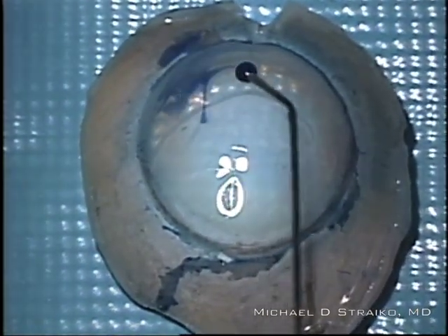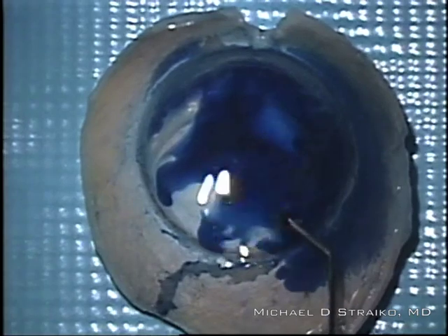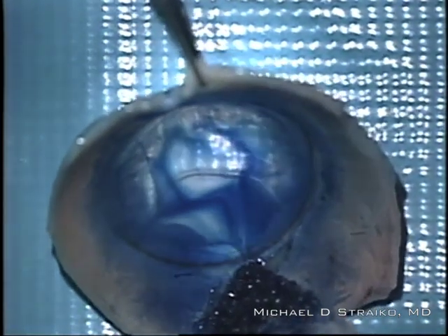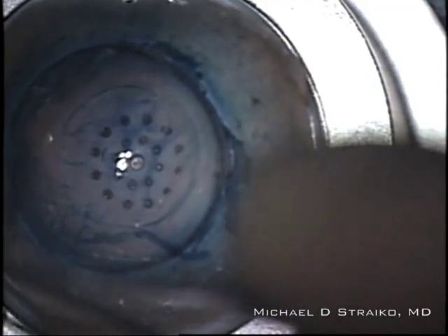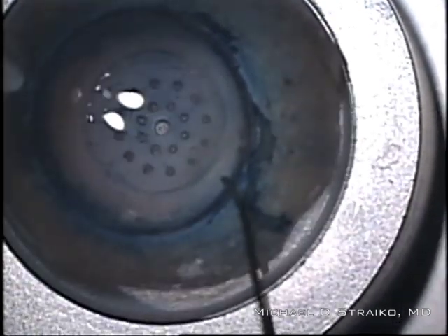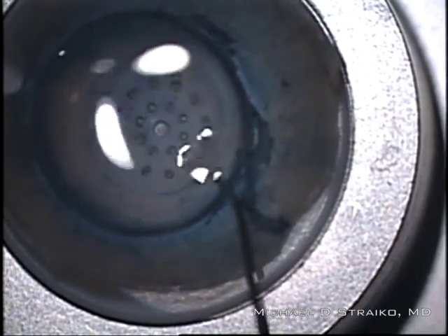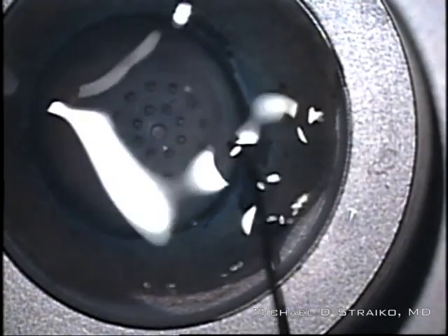I just think it's an interesting exercise to look at how a different graft affects the surgery on a very similar anterior segment. I've already completed the cataract surgery and I'm doing the same graft preparation steps. I always grasp the graft near the notch in the sclera because that's where it's hinged, so when I tilt it and pour the fluid off, it helps to flatten the Descemet where it's already been pre-stripped. Again I'm punching with a 7.5mm Moria punch — I think the Moria punches are the sharpest and I like them the best.